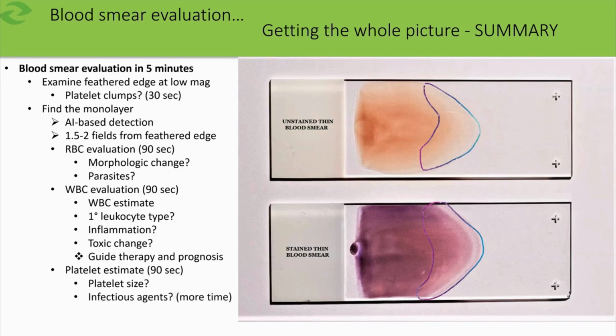Now that would require a little bit more time. Sometimes, especially Anaplasma in dogs, that can be a tough one to find. But if you have digital images and AI that has that capability, then that will help you further refine your time.